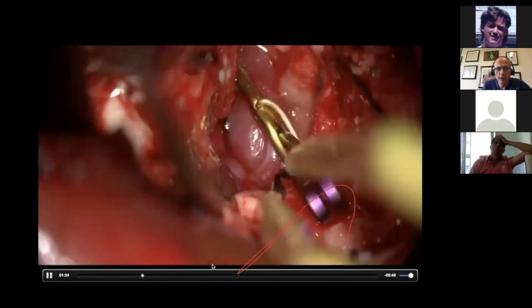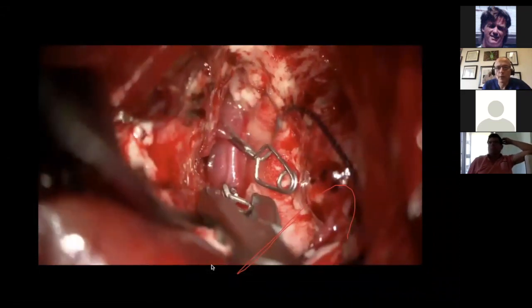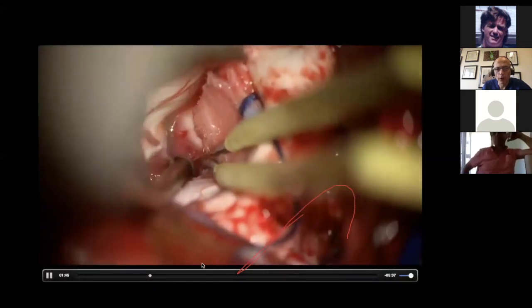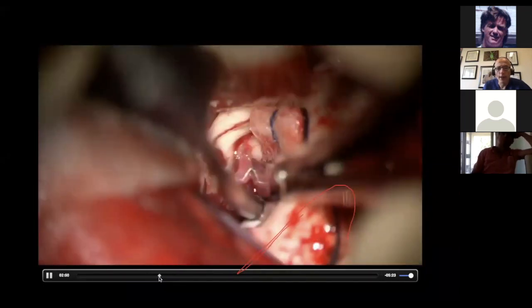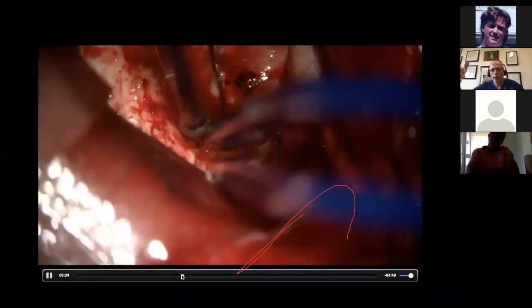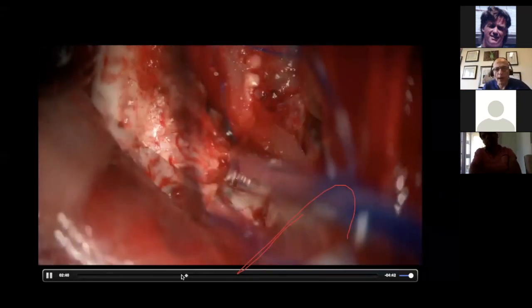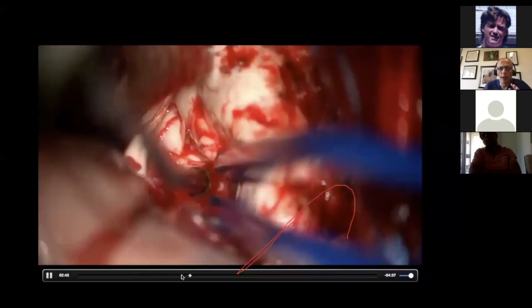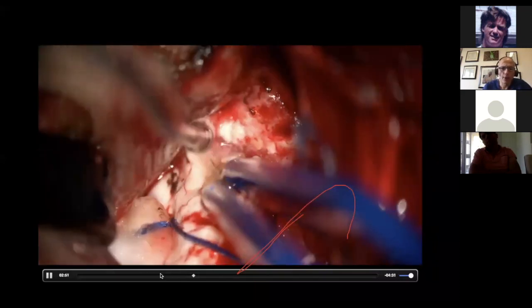Taking the small feeders, temporary clip first, I'm not sure. I am sure now, I'm taking the temporary clip, putting the permanent. And further opening the choroidal fissure, mobilizing the choroidal artery and the feeder from the choroidal artery. Then eventually we'll find the PCA feeders and skeletonize the PCA underneath the AVM. See that could retract. That's okay. If you suspect it's retracting, just put the micro clip for that, okay? So further dissecting away from the choroidal fissure.